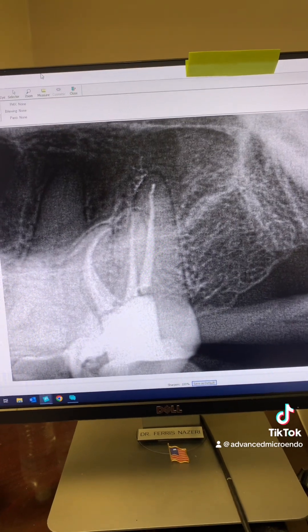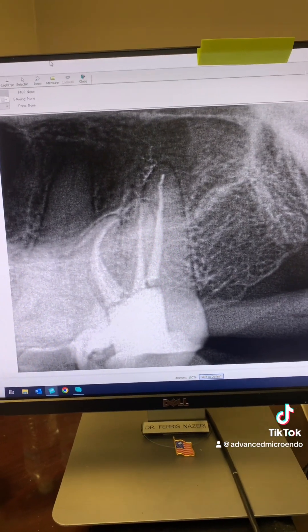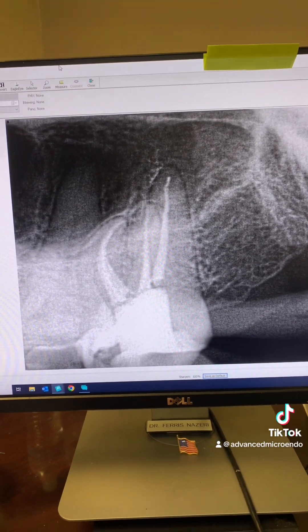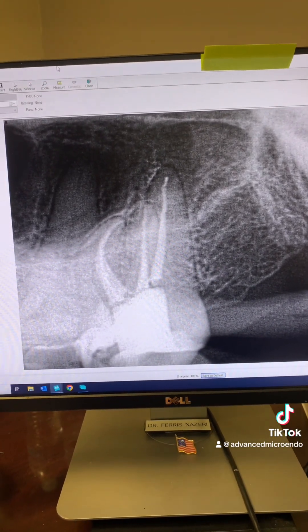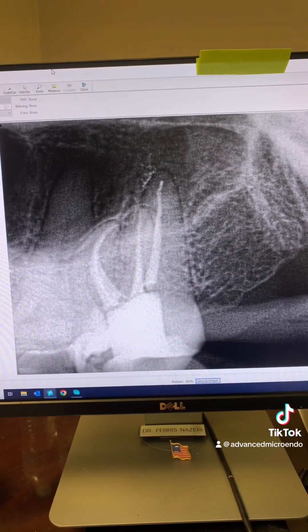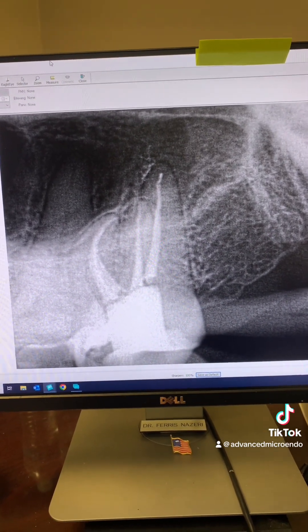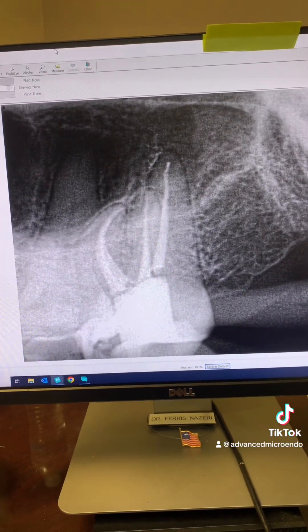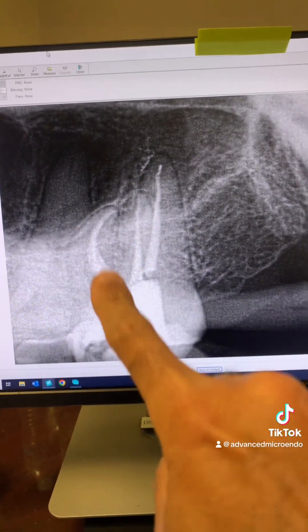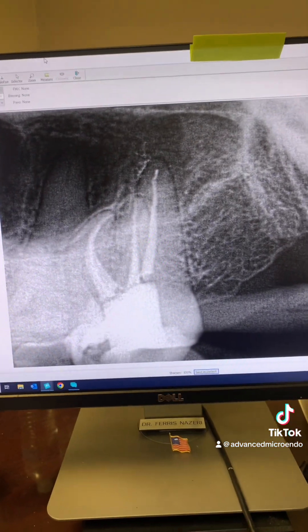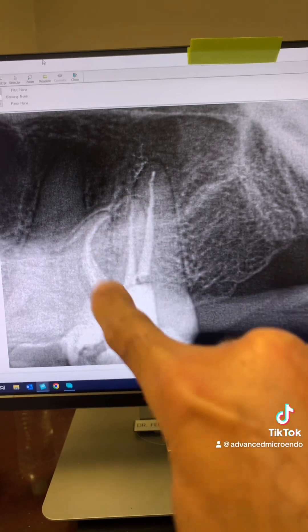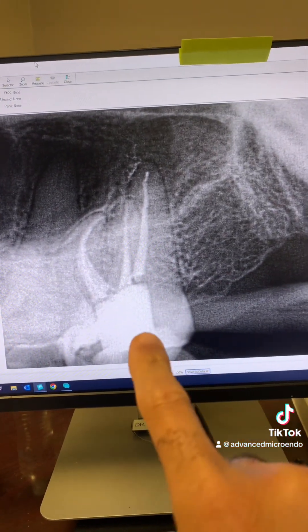Those are the things that you can't see on a PA, but you need to pay attention to. I work under a surgical operating microscope, so I will find them — if they're there, I can see them, I will find them. The mesial buccal root had three canals in it: MB1, MB2, MB3. And look at that nice curvature there.